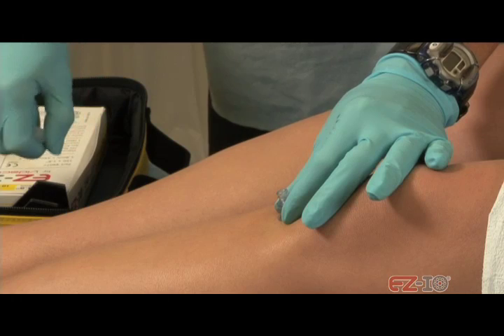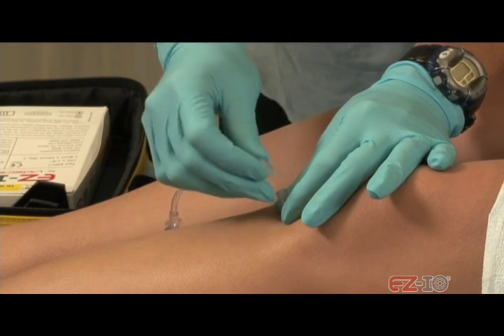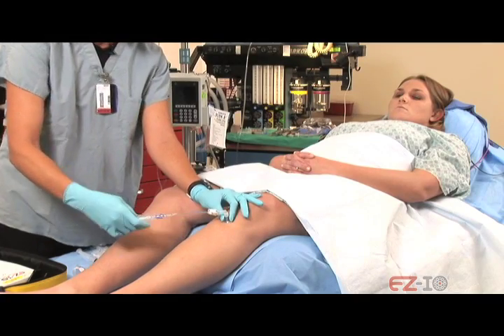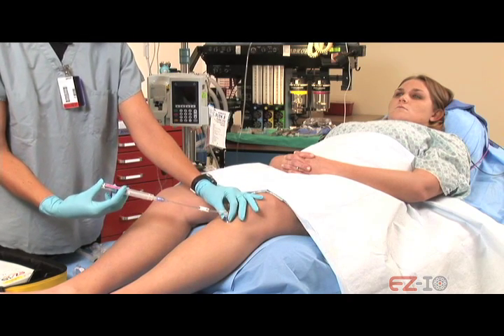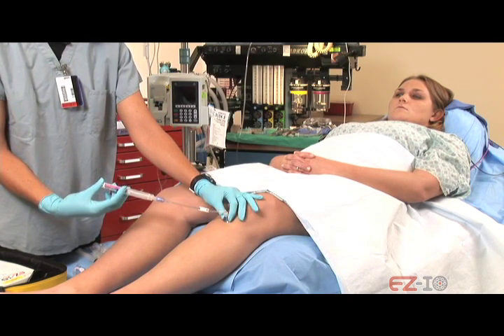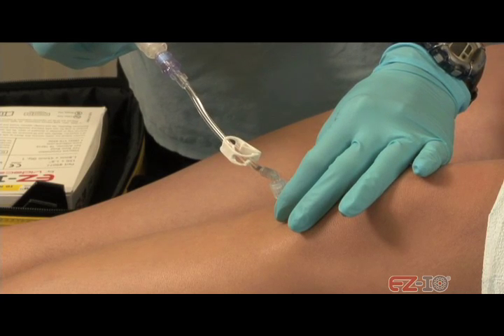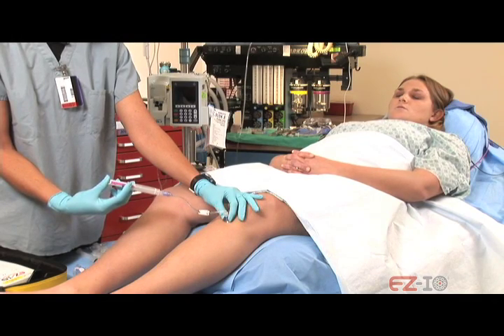This is the medication. It's going to make it numb, okay? So it's going to make it numb in there. As I'm putting it in, if I'm going too fast, if there's too much pain, let me know and I'll just slow down, okay? Here we go. Let me know if I'm going too fast. How are you doing? Fine. On a scale of 1 to 10, what's your pain? 2. Okay. And now? Maybe like a 3. Okay.